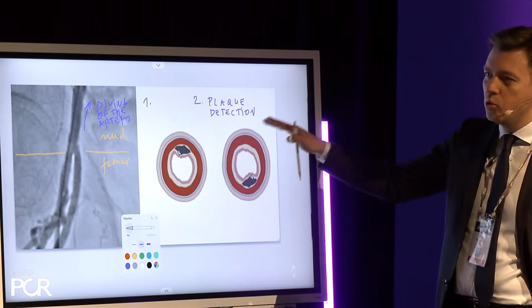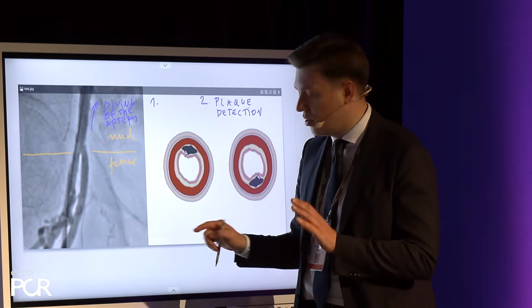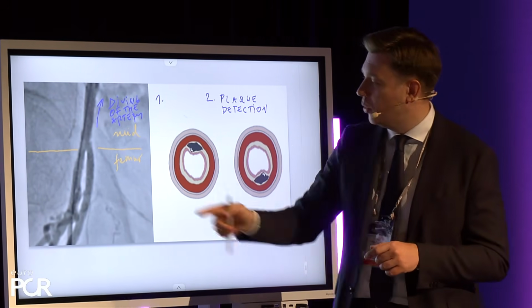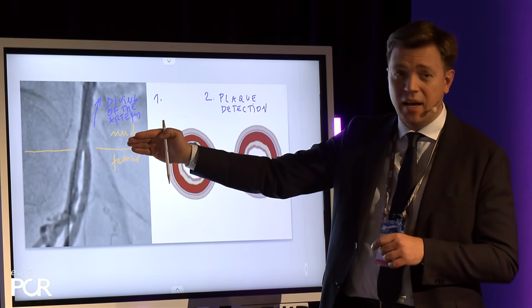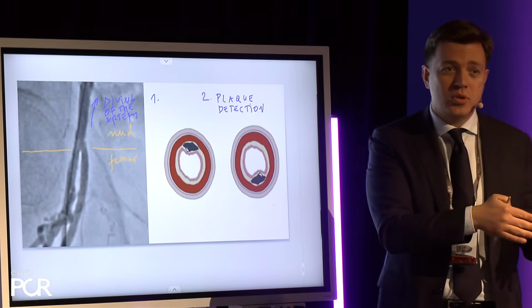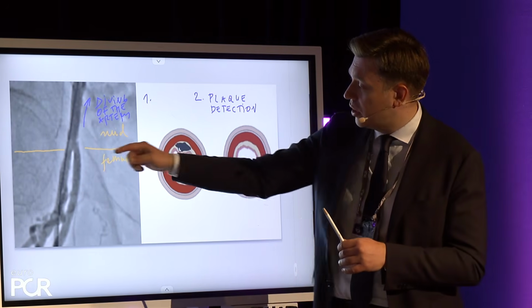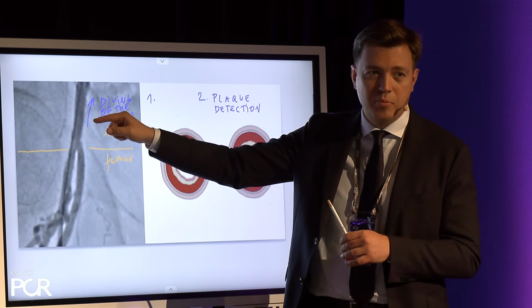There were, I think, 2 important points. We use CT, and we said ultrasound alone is not enough. We need to prepare for vessel closure by knowing the anatomy of the patient. The CT scan will tell us at least where the bifurcation is. In this example, the bifurcation is high, already at the mid of the femur. We know that going into the procedure, so we do not have to do any contrast injection. We take the ultrasound, and with ultrasound we can go just a little bit above the bifurcation, and then puncture.